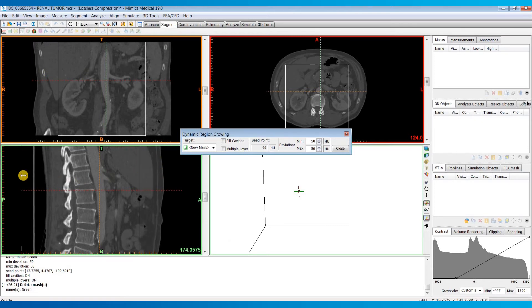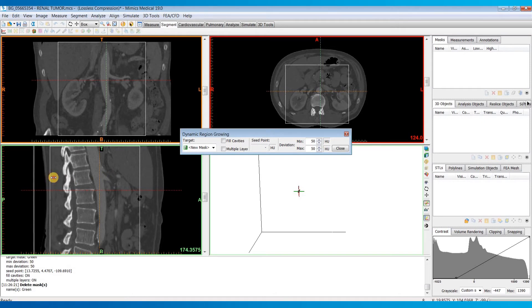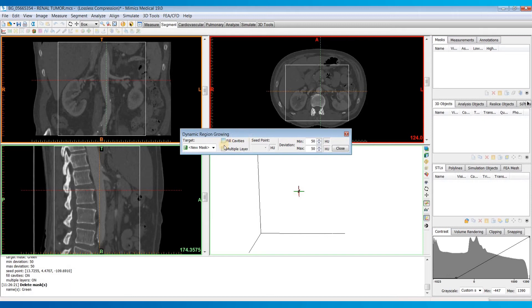So I'm going to try to segment out this abdominal aorta, so I'm just going to move this in a little bit. And in this dialog box we have a couple of different options. We can check this fill cavities box if we want it to try to fill in any holes within our mass segmentation.